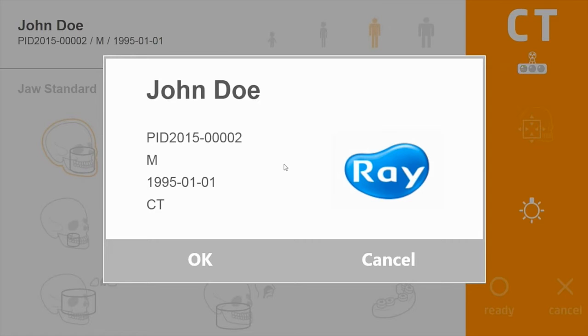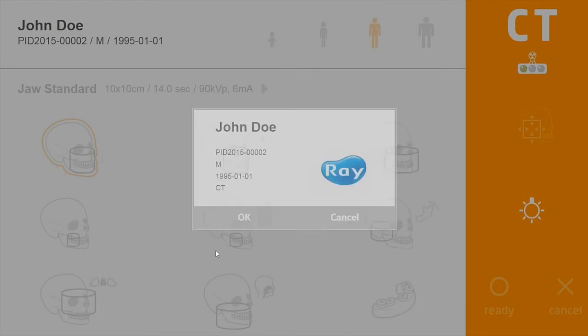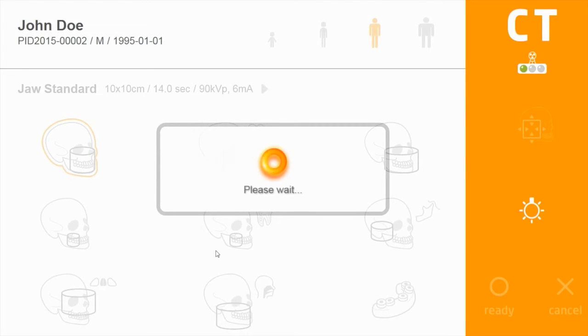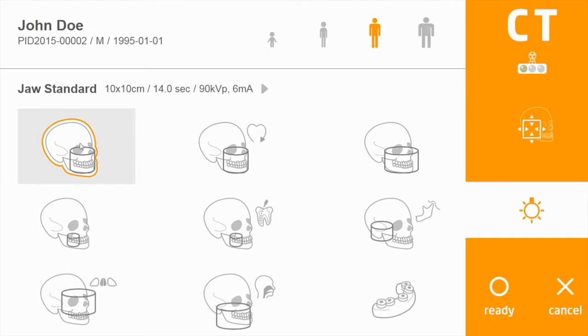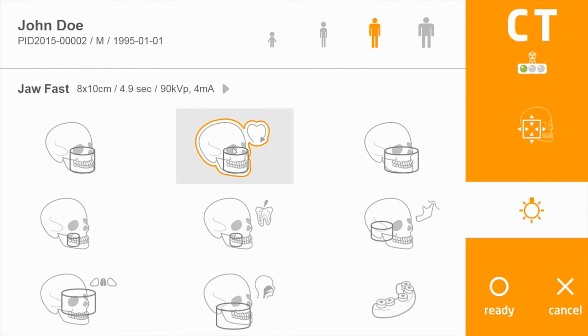CT scans follow the same concept as panoramic. The default patient size is medium adult, and you can adjust the kV and mA settings. The default option is the standard protocol with 300 micrometer resolution.